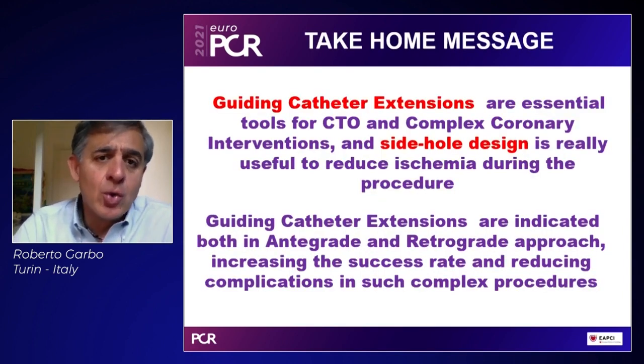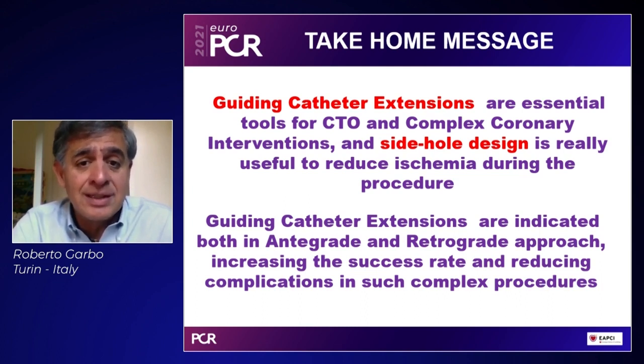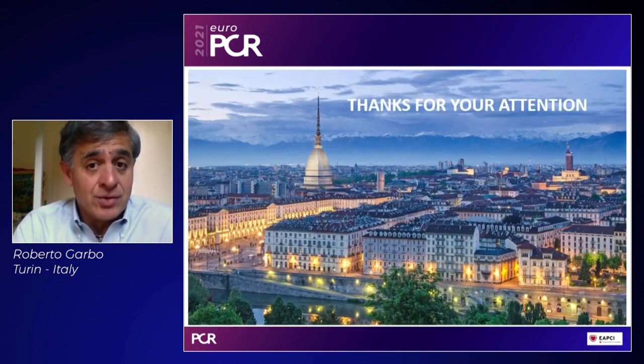So to conclude, guide catheter extensions are really essential tools for CTO and complex coronary intervention. And the new side hole design is really useful to reduce ischemia during this kind of procedure. And the guide extension is indicated in both anterograde and retrograde approach, increasing the success rate and reducing the complications in such complex procedures. Thank you very much for your attention.